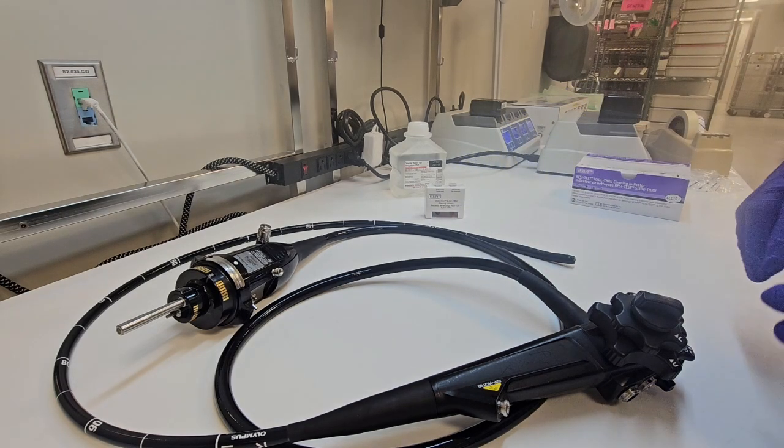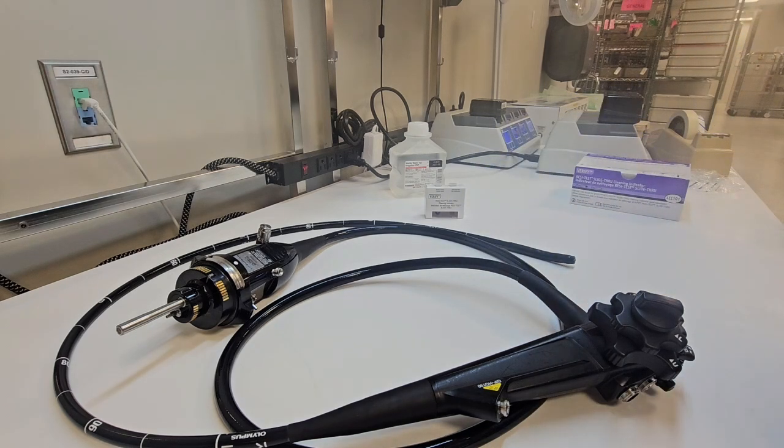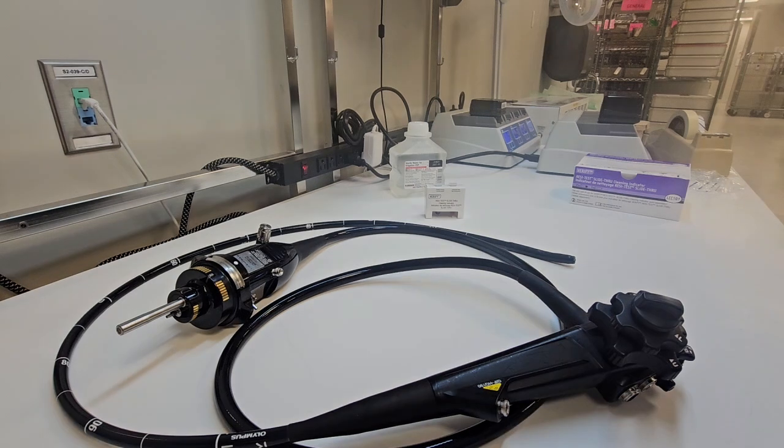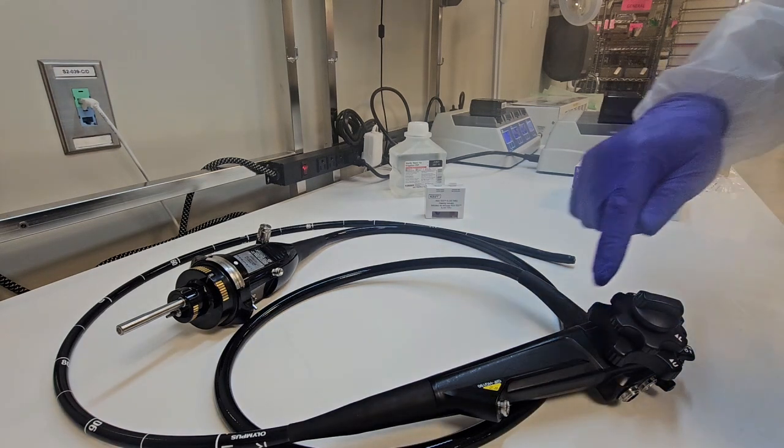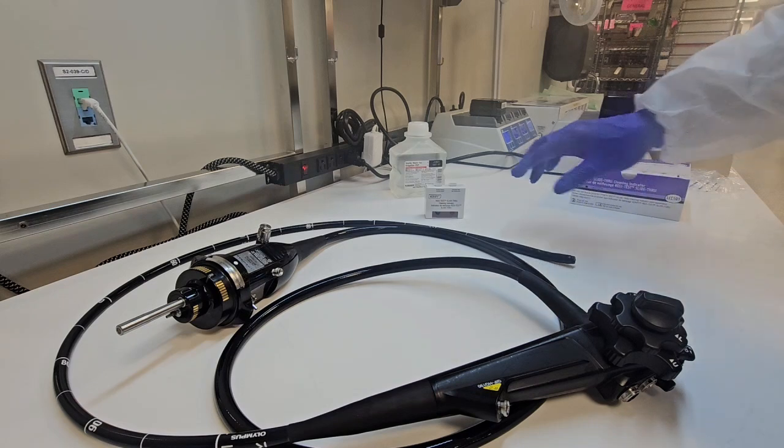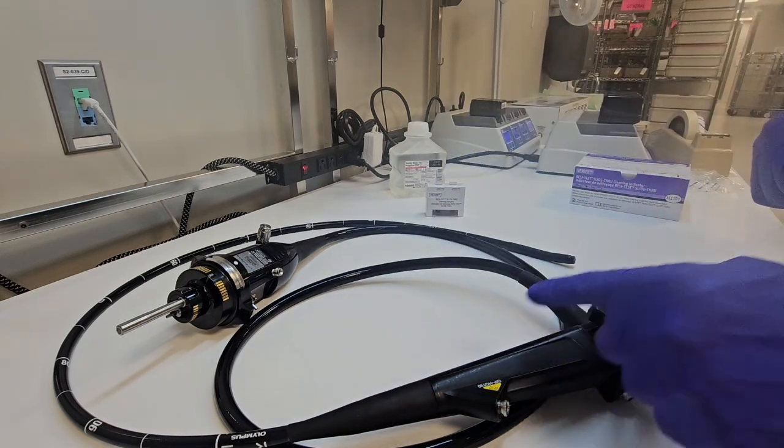That squeegee came through. The test is negative. So I did a good job in cleaning the internal surfaces of my flexible endoscope. Am I done? In my opinion, no. You tested the internal surfaces. Don't we clean the external surfaces of the scope as well?